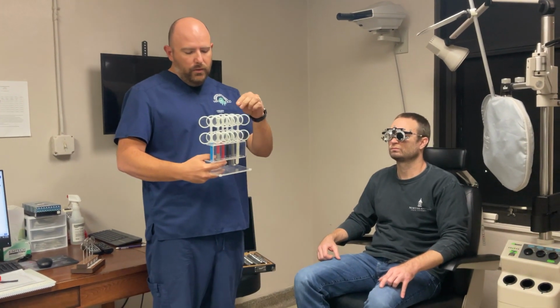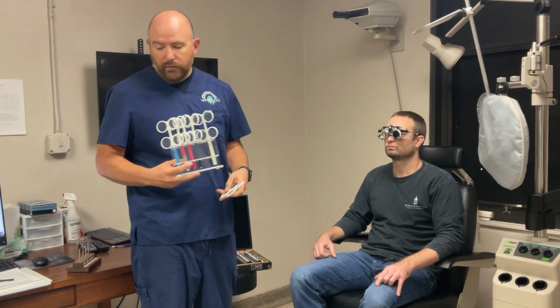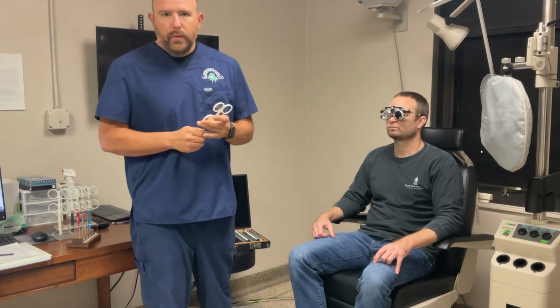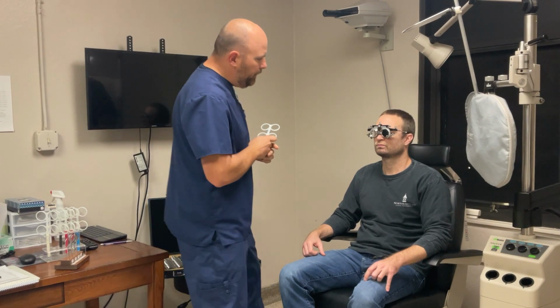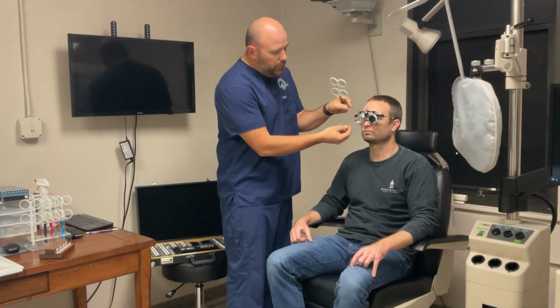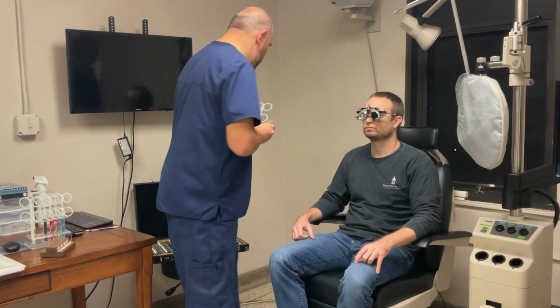But the only way that we can do that in the trial frame refraction here, is to have the J and D. So now we're going to, instead of having a +1 or -1 and only showing in one lens at a time, I'm going to grab the plus or minus half flipper. The other thing I'm going to do is I need to bracket. So we're thinking that we're somewhere around -4 to -4.50. So what I'm going to do is I'm going to remove the 4.50, and instead I'm going to put in a -4.